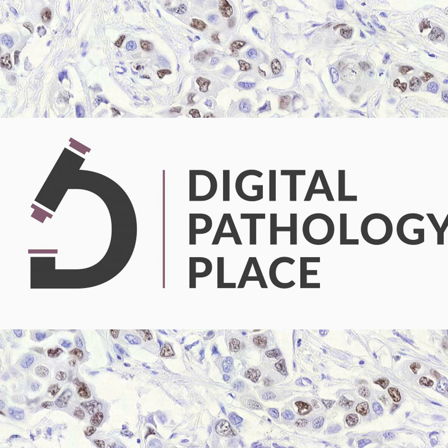The other thing that people fail to consider is how you deploy this in a large institution. So, for example, you go to a place like Mayo Clinic or Cleveland Clinic or Memorial Sloan Kettering or some very large institution, Texas MD Anderson, their enterprise IT and security people are not going to let you build a data center in the pathology department. So your pathology images will have to fit in with the rest of the enterprise. And if every other image in the hospital from every other department is in DICOM, they're not going to be excited with you wanting to deploy a proprietary solution.